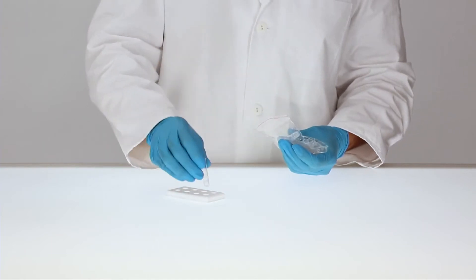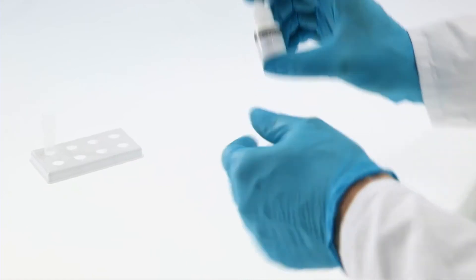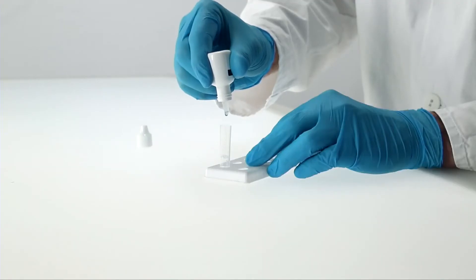Place a clean extraction tube into the reagent holder. Gently mix the buffer by carefully swivelling the bottle. Make sure to hold the buffer bottle vertically and add 10 drops to the extraction tube.